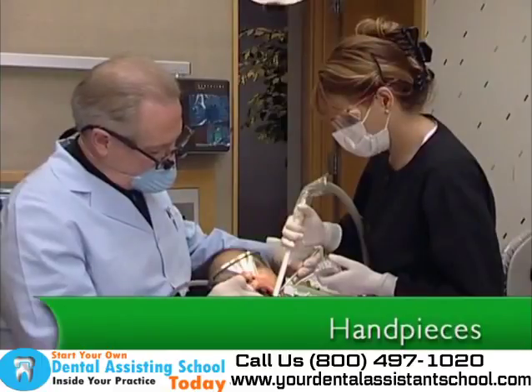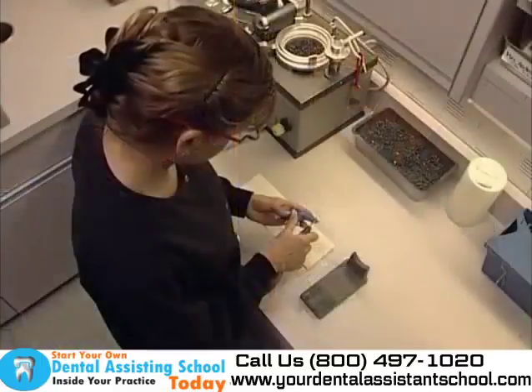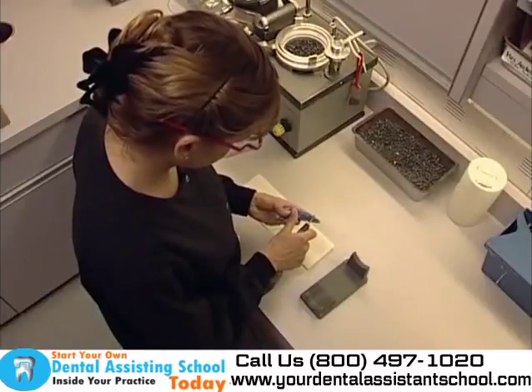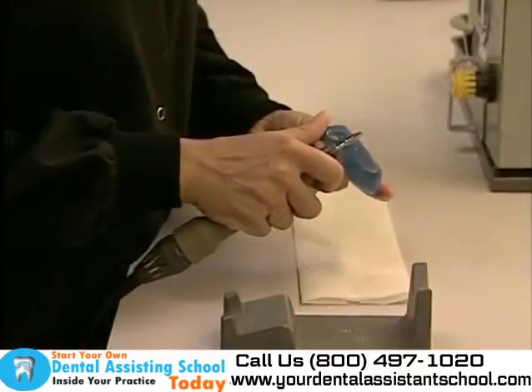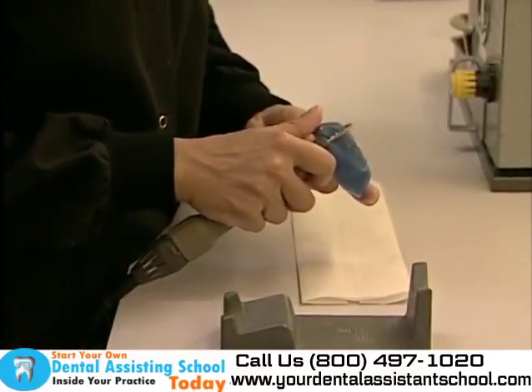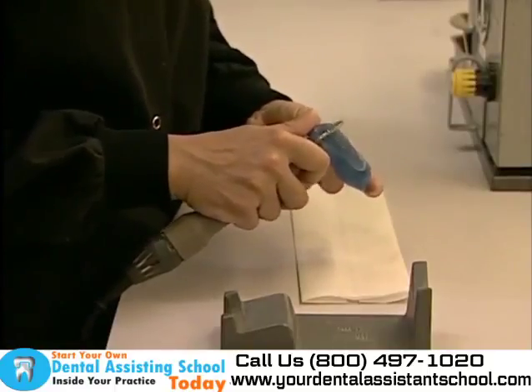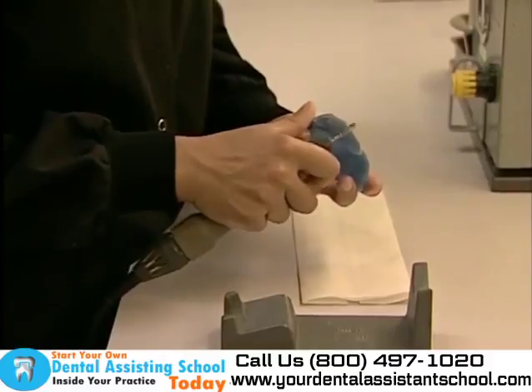Handpieces are the tools that hold polishing and cutting instruments called burrs. They are also utilized in the laboratory, for example, in fabrication of custom trays. Handpieces are attached to an air compressor, and at one time were called the dentist's drill. The conventional speed and the high-speed handpieces are the two types typically used.